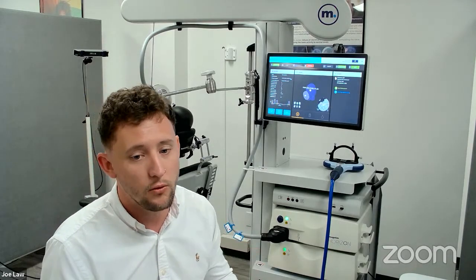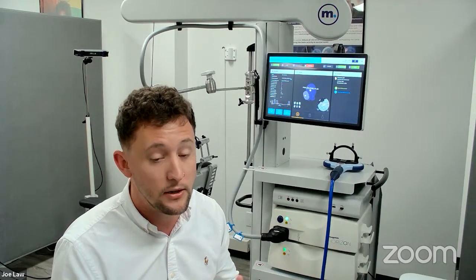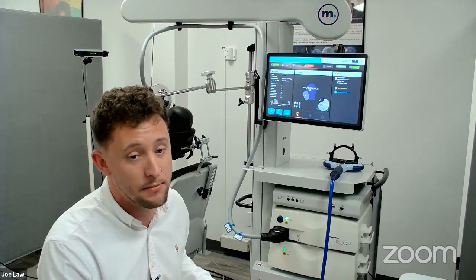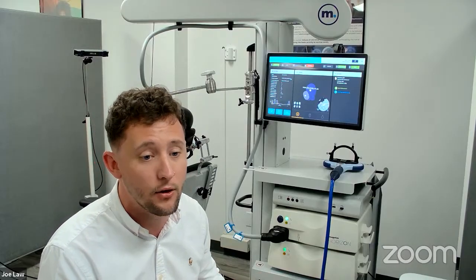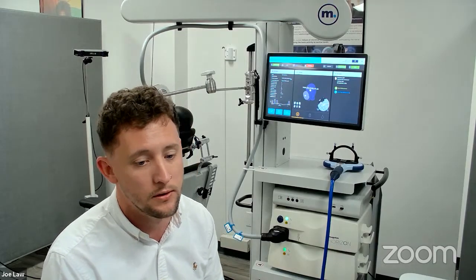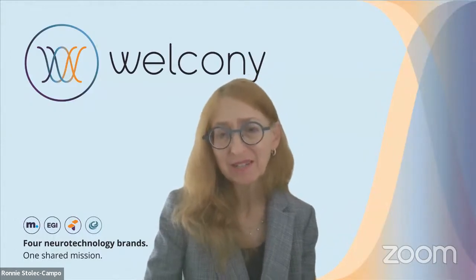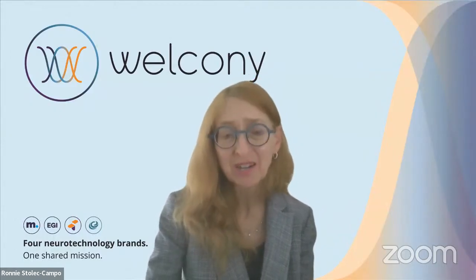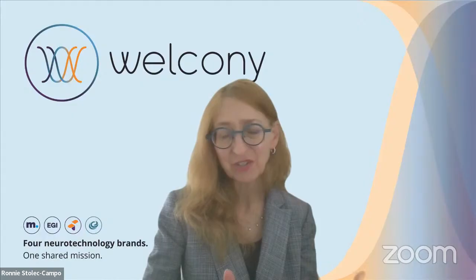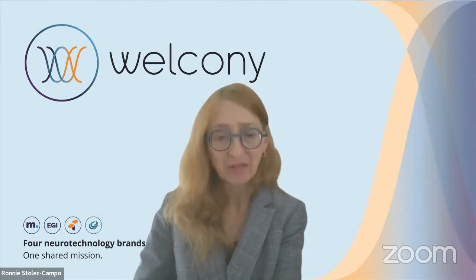So again, you don't need an MRI, you don't need an fMRI, anything like that. But we do give you the option to add XYZ coordinates into the system that have been transposed from an MRI or an fMRI if you want. But again, it is not needed for this system. And now, interestingly, we're seeing research studies and a number of papers published that have shown that non-fMRI navigation is not inferior to fMRI navigation.